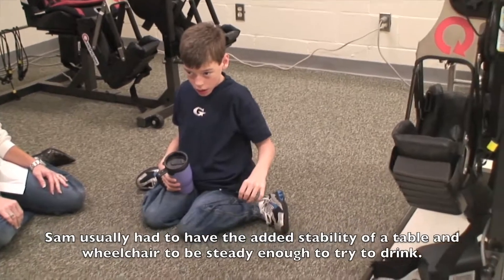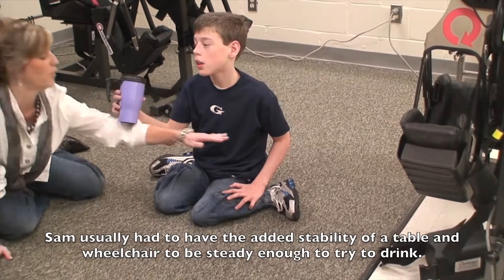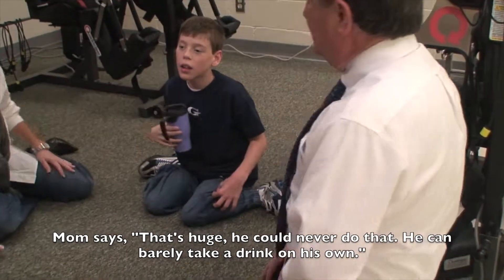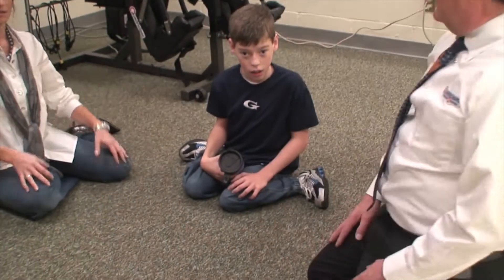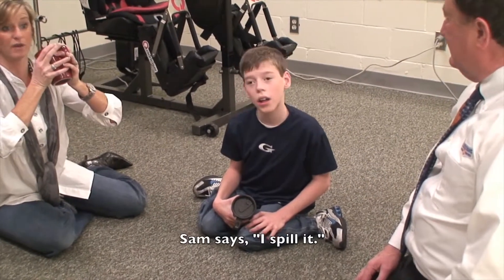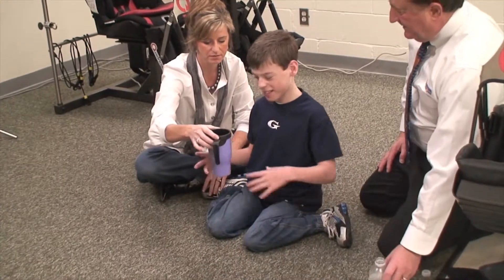Even in his wheelchair sitting at a table with his left hand holding on and trying to manage a small juice box — with support like a table he could do it one handed. Pretend like there's a table here. See, that's huge — he could never do that. He can barely take a drink on his own. He puts his elbows on the table and grabs the cup, but the minute he starts coming toward his mouth he's afraid he's going to fall and spill.